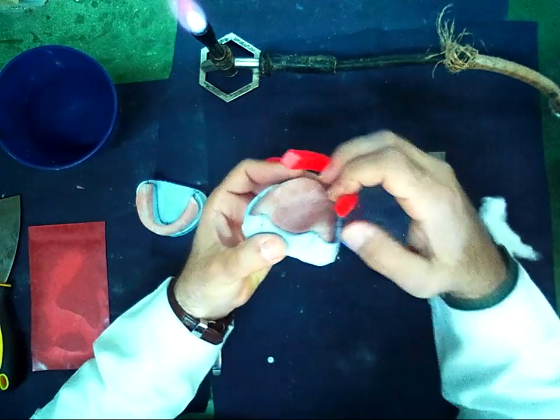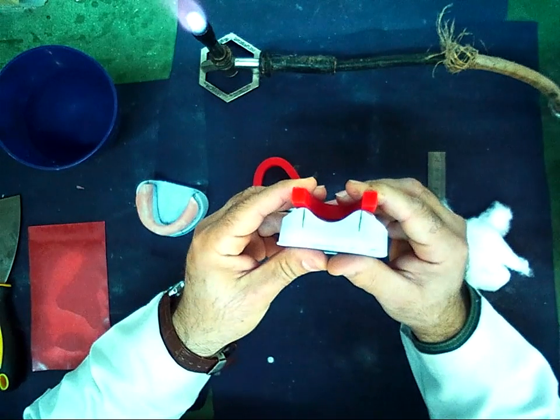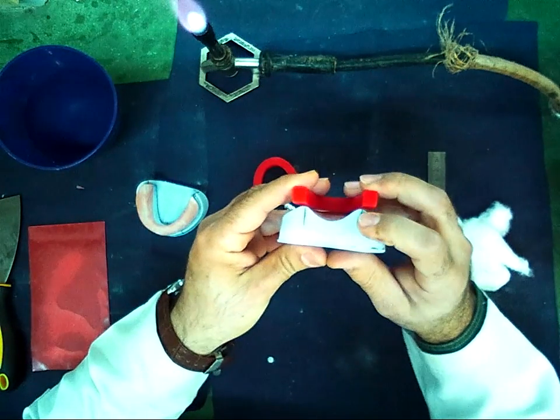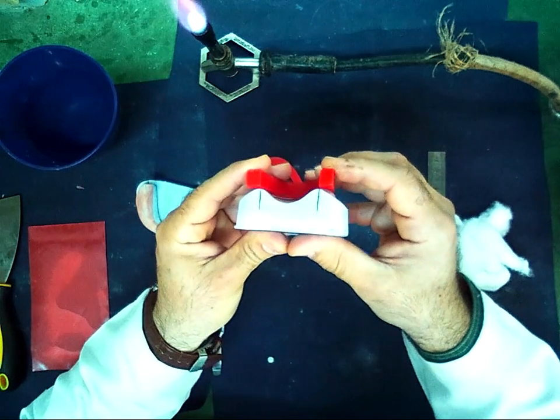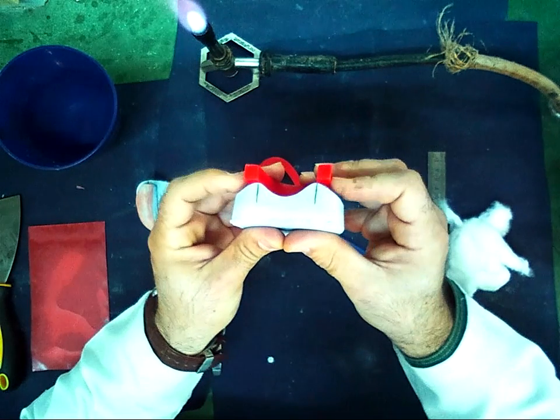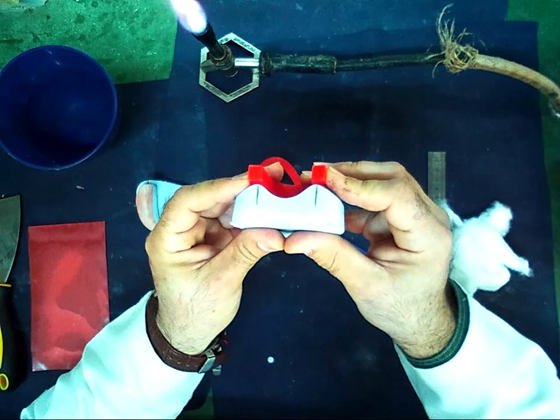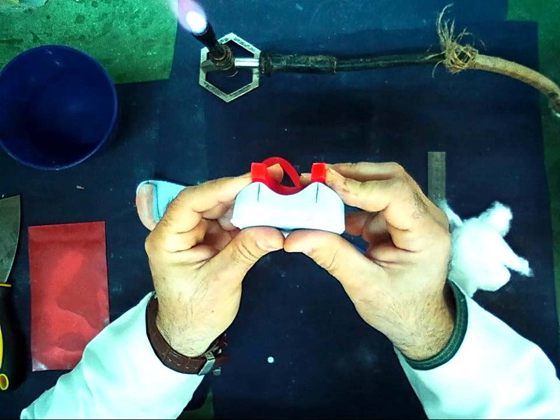The wax should be in the middle of these two lines, which represent the crest of the alveolar ridge. When I see my wax, it is wider than these two lines, so I must do it in this place, in the middle of these two lines.